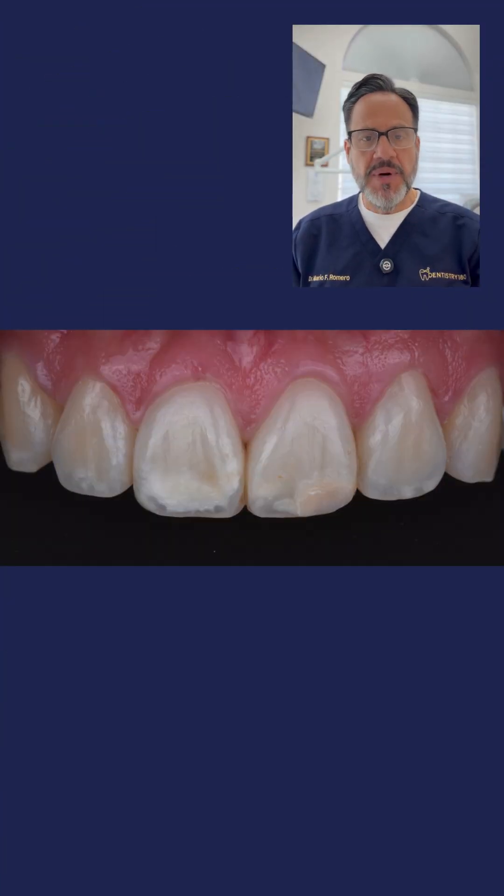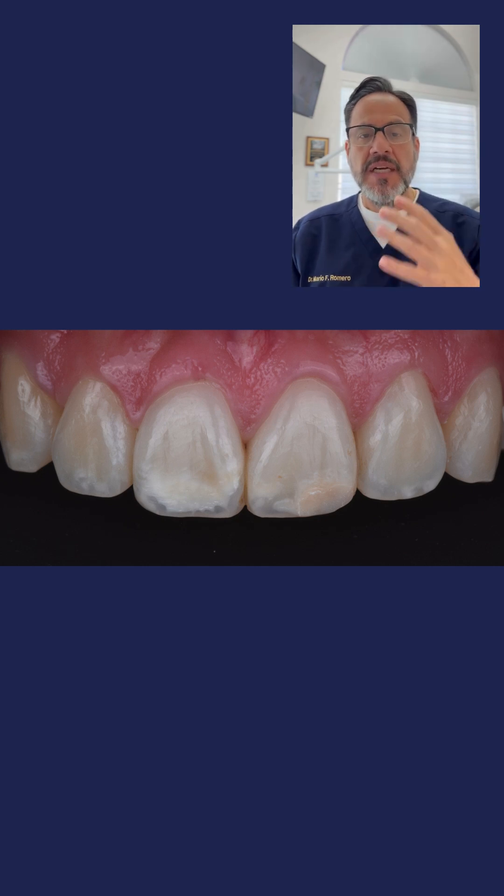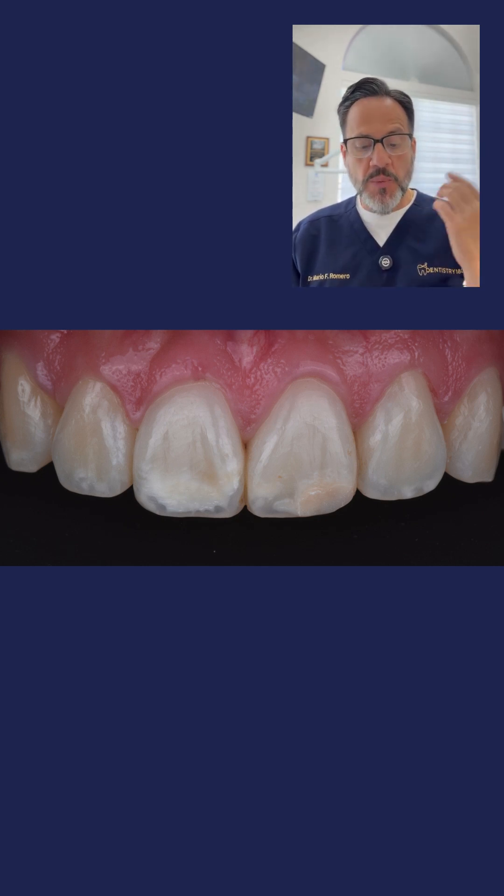What you're seeing here is a patient in my practice that came in complaining of these large white spots located on teeth eight and nine in the incisal third. What do we do first?